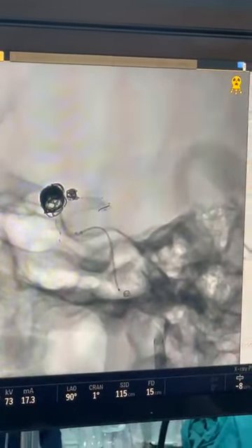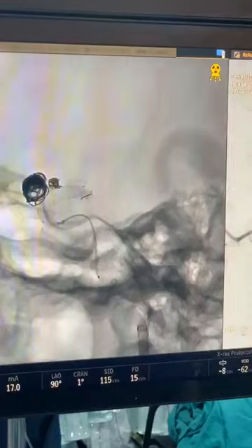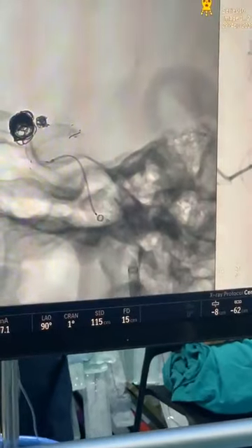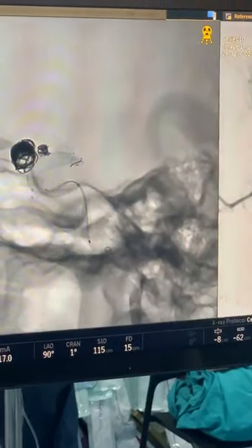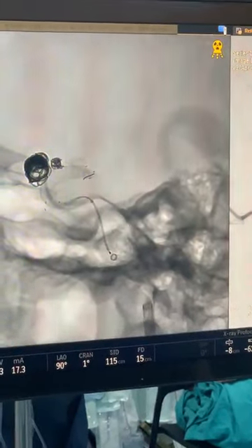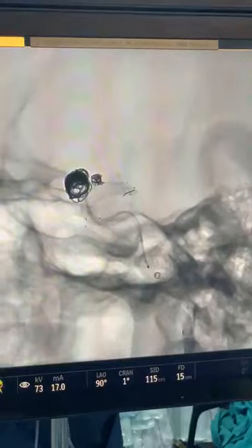So it's important that you get good support from the catheter, the microcatheter, the intermediate catheter. So here you are trying to open it a little bit by just holding the device. A little bit. So try to release a little more and see how it feels.